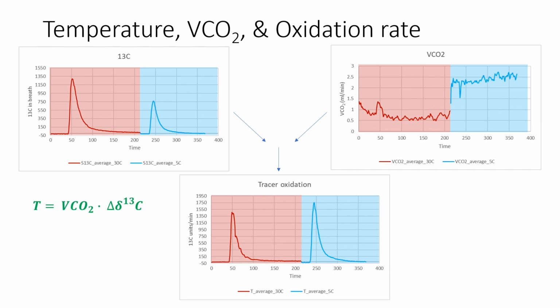This outcome actually shows that the same mice exposed to cold temperatures are not fueling their increased energy demands using glucose, but rather another fuel, presumably lipids. We will use this dataset to take you through the specific calculations that are needed to determine actual rates of tracer oxidation, so you can examine carbon-13 tracer oxidation using other experimental interventions and other types of carbon-13 labeled tracers.